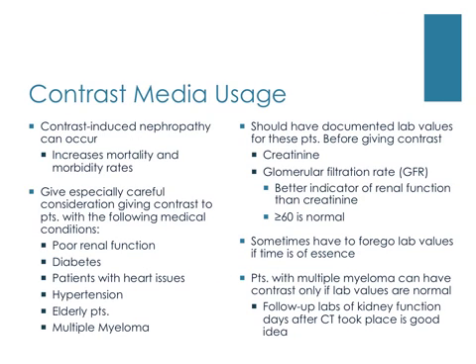Great care must be taken when administering contrast, as we've already said. Contrast-induced nephropathy can occur, which is deteriorated kidney function as a result of iodine-based contrast, and has been known to significantly increase morbidity and mortality rates.